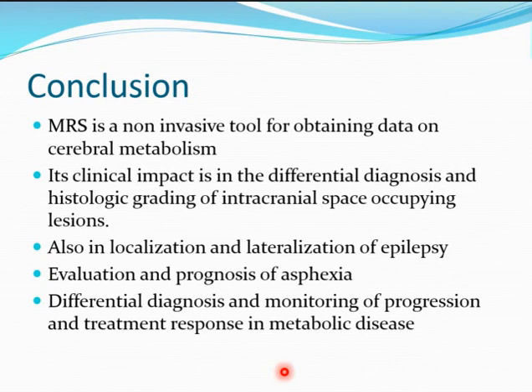At the end, again, never ever interpret a spectrum without having a brain MRI image, without having sufficient clinical data and lab tests. You are a clinical radiologist. We are not photographers. We need all the clinical data to give an appropriate diagnosis and differential diagnosis.